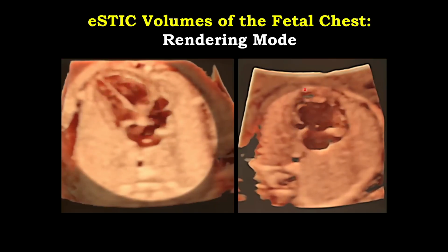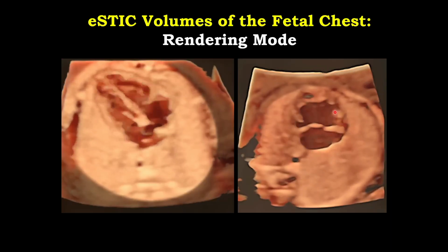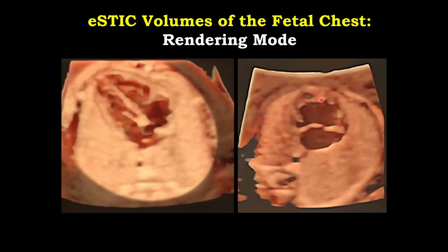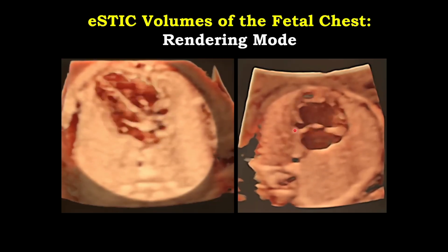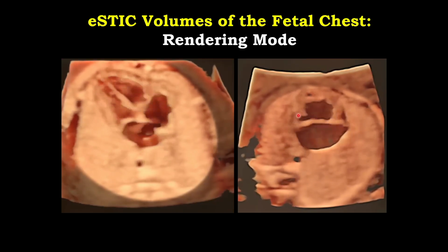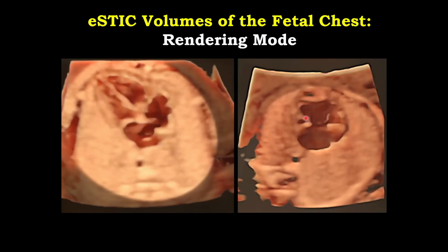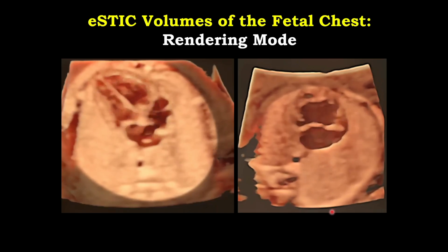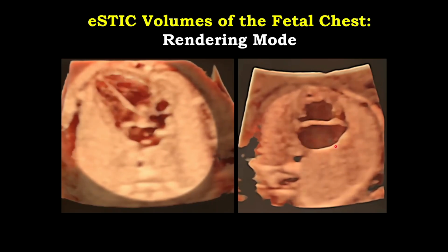We can clearly recognize that this single functional ventricle is anatomically a right ventricle, because we can see very clearly the moderator band here, and this is a teeny tiny hypoplastic left ventricle that represents the outlet chamber, and we can see also the bulboventricular foramen here. So all of this we can see in one image, and we can get a lot of details here.